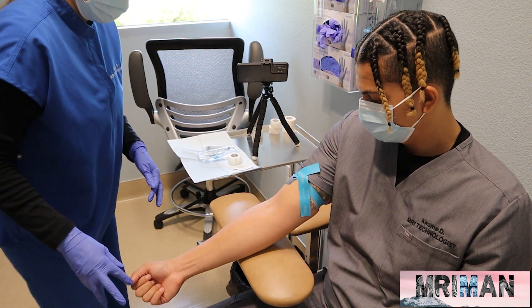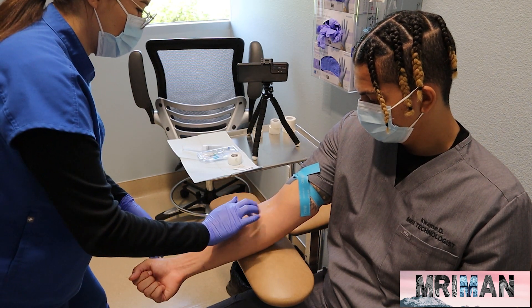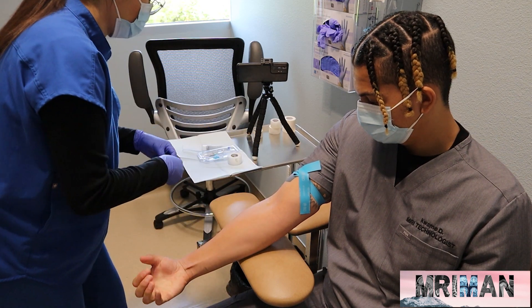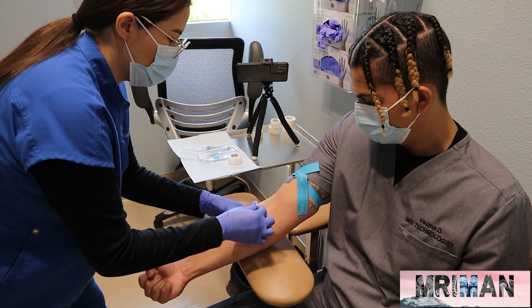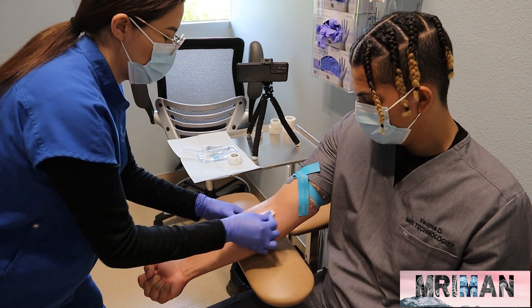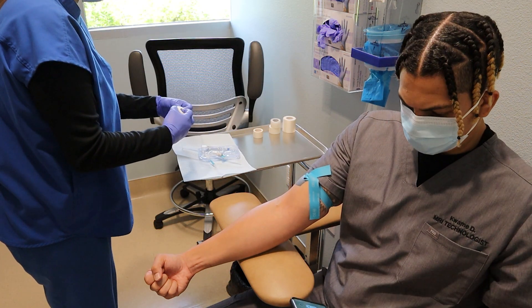And of course, talk to your patient, let them know what you're doing. He is pumping his fist a couple of times just to get that blood flow. And I'm going to feel for a vein. And now that I've found one, I'm going to take my alcohol swab or prep pad and I'm going to wipe the area starting from the center and working my way out in a circular motion.